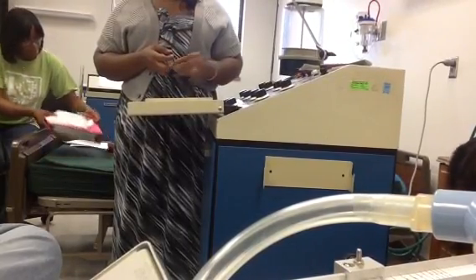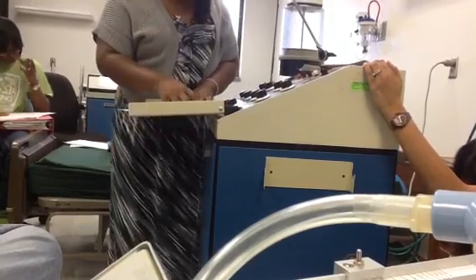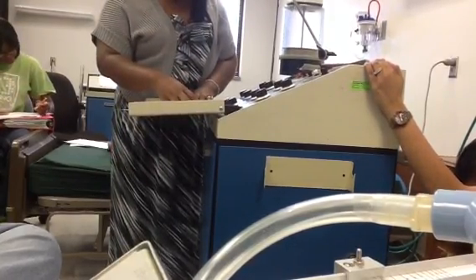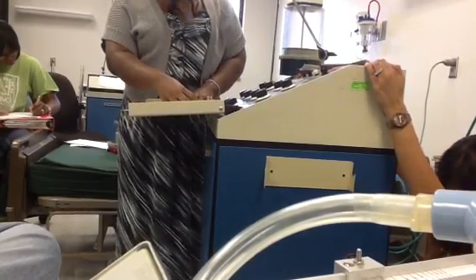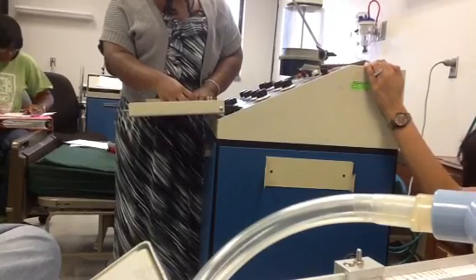Rate was, by the way, from mode down to tidal volume are all set parameters. So these are things that you set on your patient.